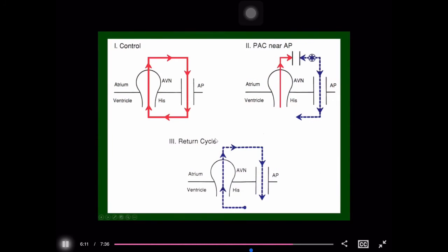So this is how it's shown in a schematic. And it's very important to know this maneuver. I'm showing you for a left-sided accessory pathway, but it doesn't matter if it's left or right, atrial fascicular reentry, a classic antidromic reciprocating tachycardia with a left or right pathway. The maneuver and the concept's the same, and that is the following. With antidromic tachycardia, you go over an accessory pathway, you come back to the AV node. That's the circuit.